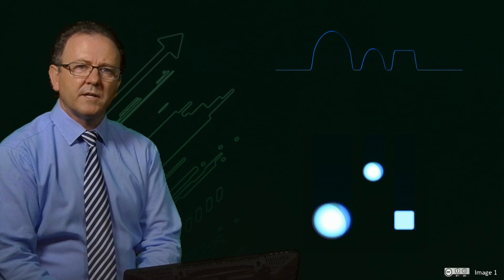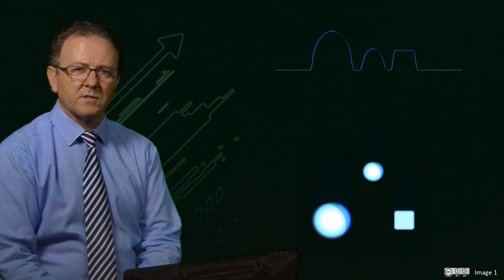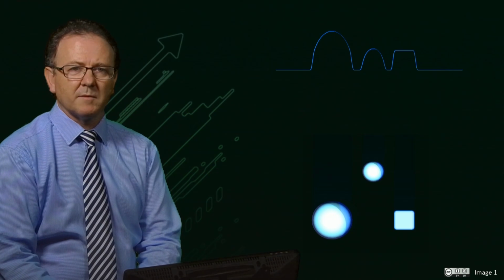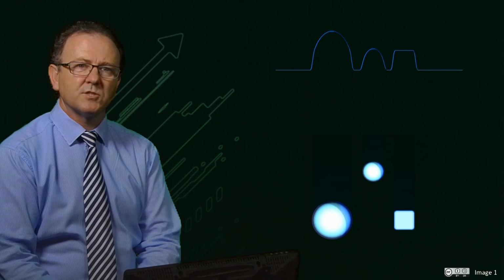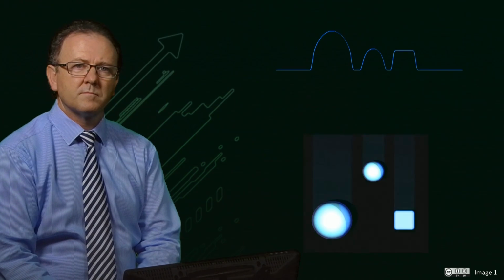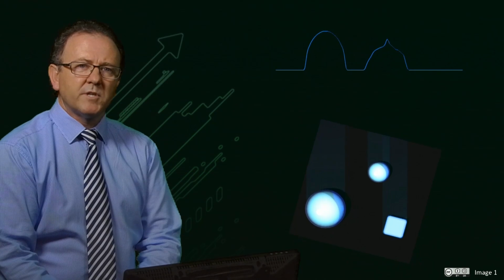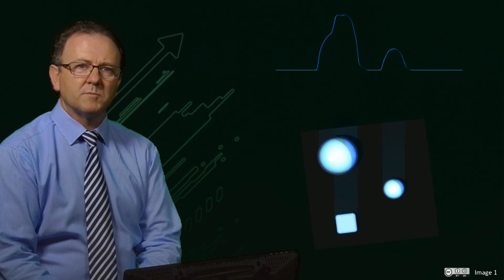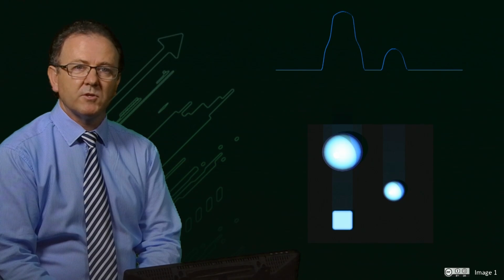We can apply this gradient along any direction in the plane of the slice, and the projection will change as a function of the direction. For simplicity in this animation, rather than rotate the direction of the gradient, we rotate the sample and show the projection along the horizontal axis as the sample rotates. The projections obtained in this way can be used to back calculate the original shapes of the three objects in a manner very similar to that used in CT imaging.